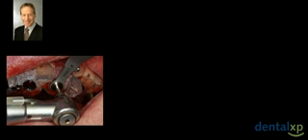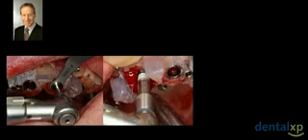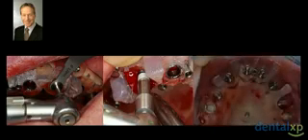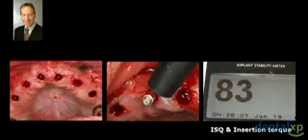We're going through the sequence of doing the drilling, which actually is quite quick. We're introducing the implants. Ultimately, all of the implants are introduced. And today we use either Osstell or perhaps insertion torque to make sure that the implants that are placed have some degree of firmness and competency. Because when you insert these devices into these little cylinders, you lose all of your tactile sensations as to what we're really talking about in terms of resistance.